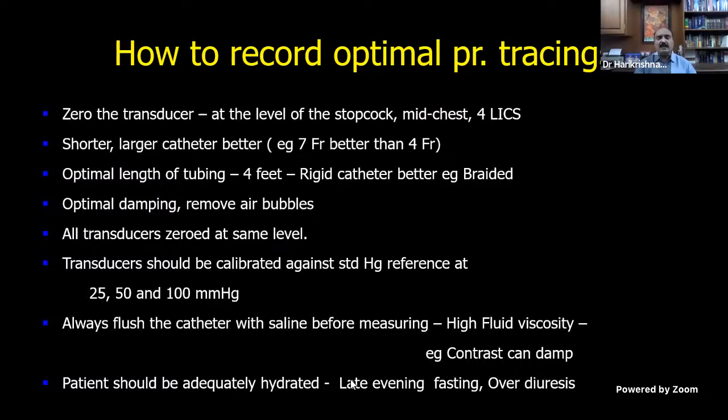And now you should always flush the catheter. When your contrast is in the system, it will dampen the pressure. So always flush the catheter with saline before measuring.